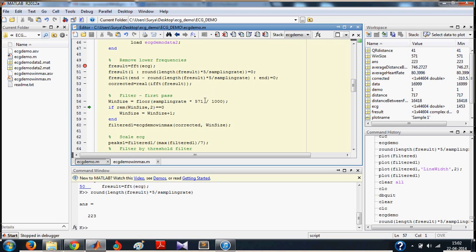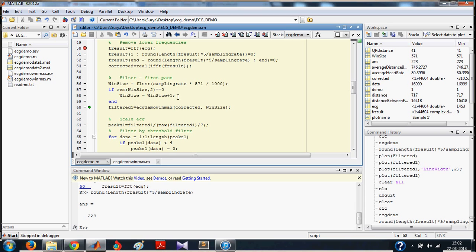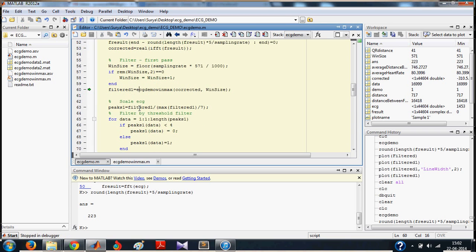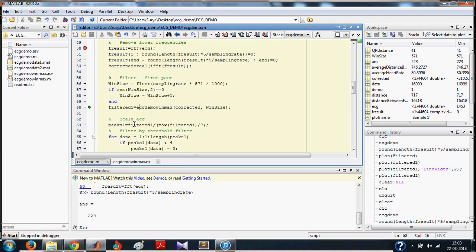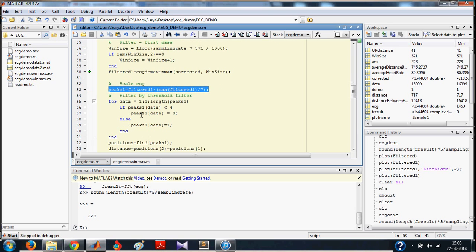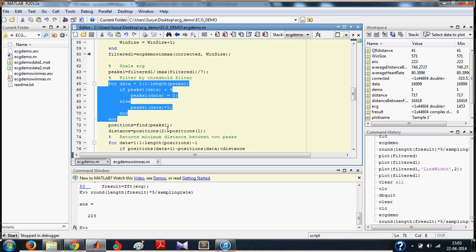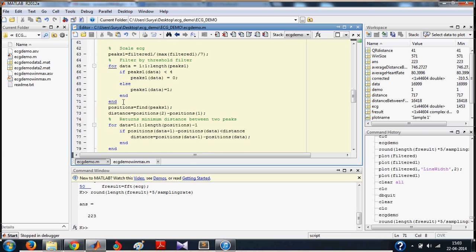You take the window size as 571. You make sure that the window size is odd. Then, you use this function, which is the windowed filter which we were talking about in the algorithm, to calculate the filtered peaks. Now, filtered 1 is normalized to the value of 7 here. And what this loop corresponds to is, if the value of the peak is less than 4, then consider it as no peak. And if the value of peak is greater than 4, take it as a peak.